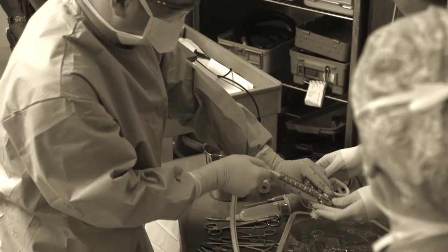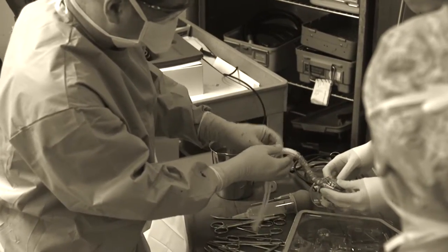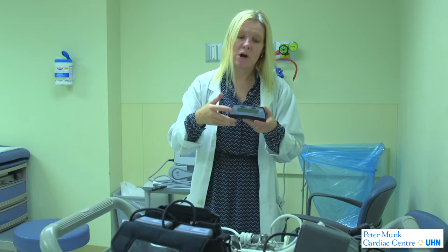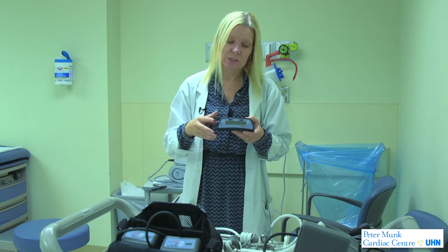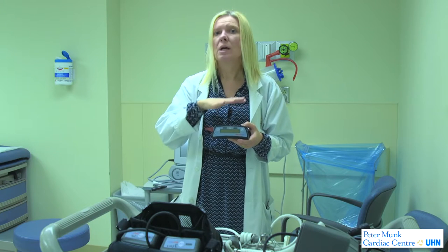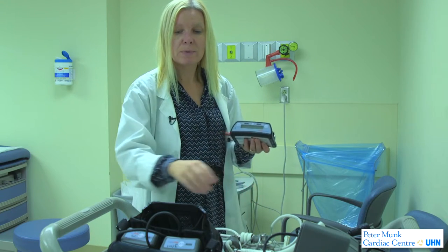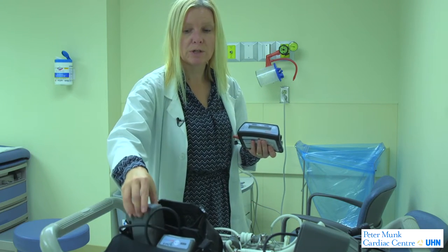In order for both these pumps to work, the patients need a little computer and batteries. This is the hardware controller — a computer system that tells the pump what to do. It will also tell the patient if there are any problems and how to solve them.